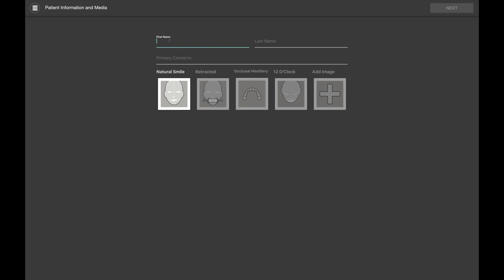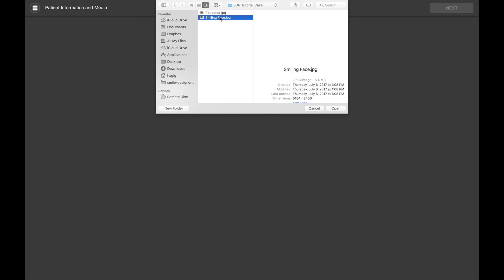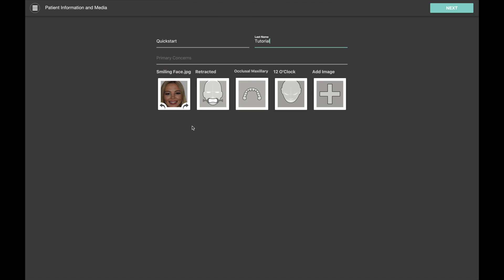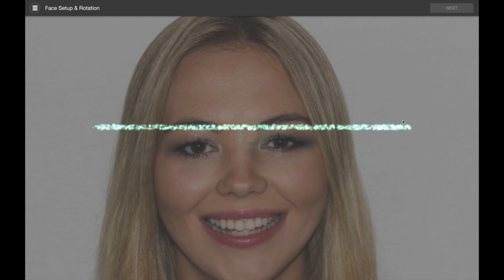The first thing we do with a new case is enter some basic information. Here I'll put 'Quick Start' as the patient's name and I'm going to tap on the button where it says natural smile and bring in the smiling face of the patient. Smile Designer Pro supports a photo protocol that includes the retracted picture, the occlusal picture, 12 o'clock, and actually any arbitrary collection of pictures that you want to bring in and work with. But for this tutorial we're going to keep everything simple and just use the smiling face, so we'll click the next button.